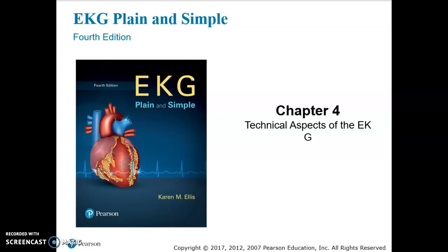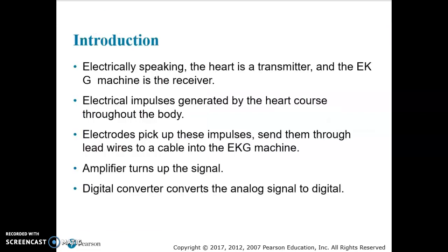Chapter 4, Video 1. Today we're going to talk about the technical aspects of the EKG. Electrically speaking, the heart is a transmitter and the EKG machine is the receiver. So please remember that. The heart is actually the transmitter.